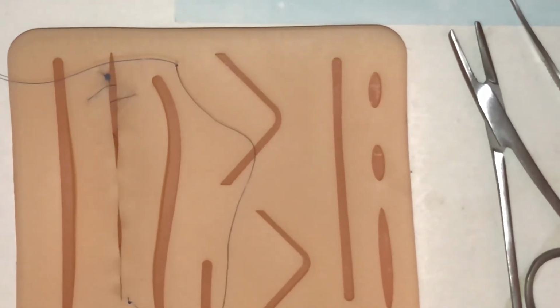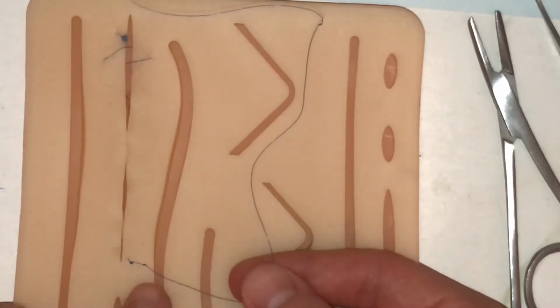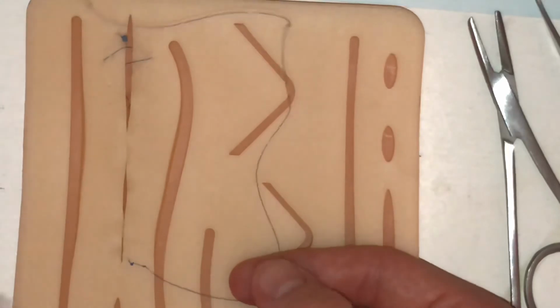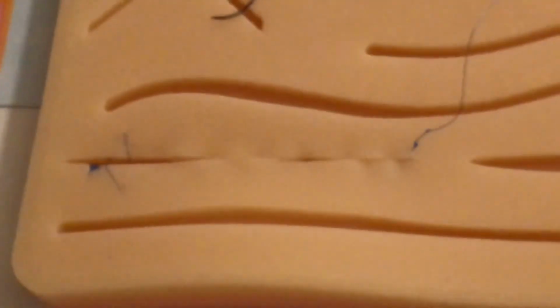You can see my closure. I just did two regular knots like the ones I did in the beginning. One of them isn't on the same path as the other two. I cut it, or I guess I used my hands and I tied it a little too far away from the entry, and then I got a little problematic in the beginning. There's the little needle we're using. The pad is coming up off the ground because I pulled the stitches too tight, and they were too close together and too far apart and above the skin, and I didn't time right and I didn't properly close. So yeah, that's a botched job.